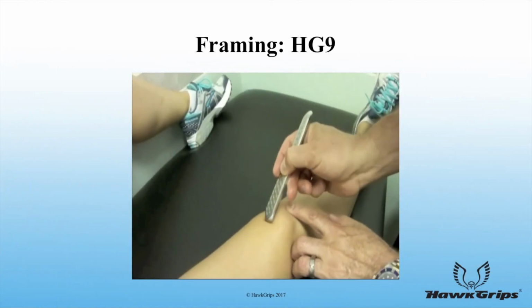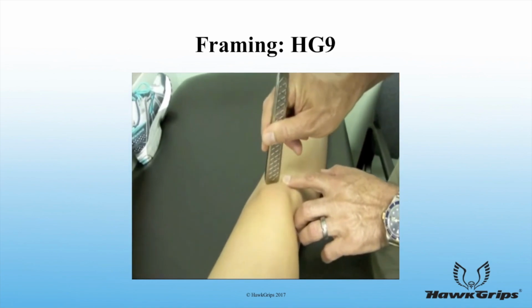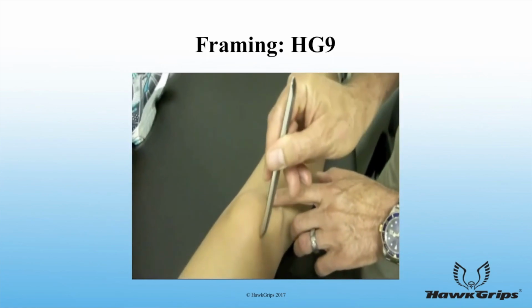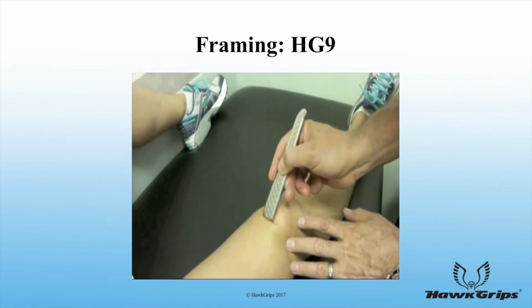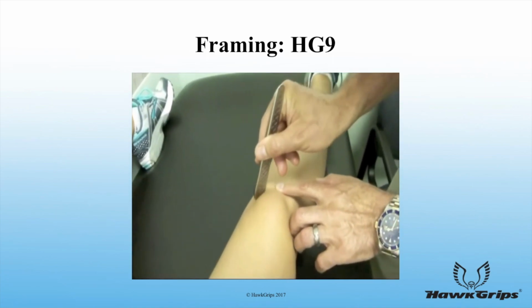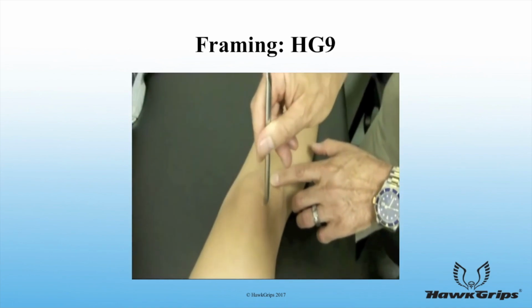Framing strokes are performed around bony contours such as the patella. The clinician should perform treatment around these bony contours to identify and clear any tissue restrictions. Additional bony regions for consideration would include the fibular head, greater trochanter, iliac crest, medial scapular border, acromion, and radial head.